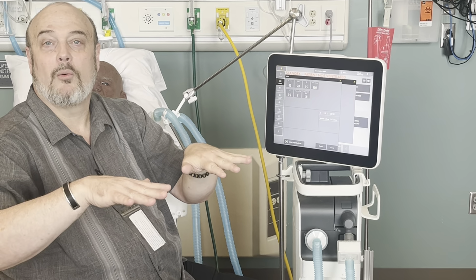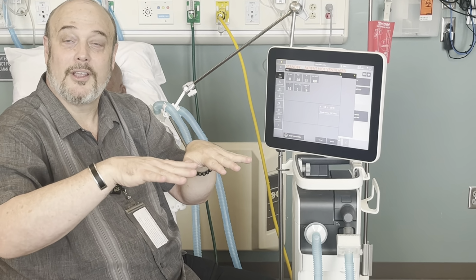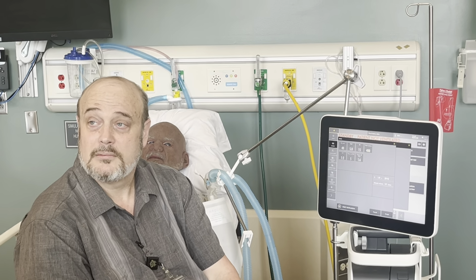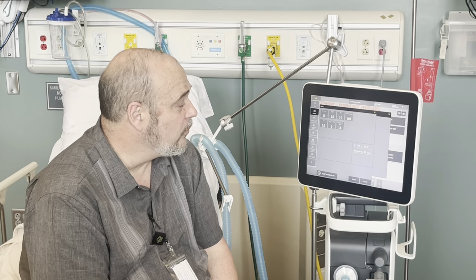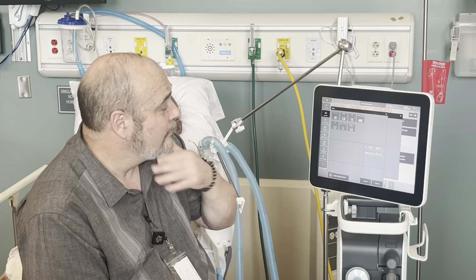It lowers the amount of work it does for you. So now you have to pull harder and more. And it's like, oh, this patient's doing really good, and it keeps giving you less and less support. So the patient has to work harder and harder because they want a higher tidal volume. That's the negative side of it. And we see it sometimes, and even we have talks with doctors, sometimes they do, sometimes they don't. I mean, it can be kind of alarming when you sit there seeing a patient do that. And you go in here and change all these buttons. You can see it shows you how the I:E ratio changes and stuff like that.